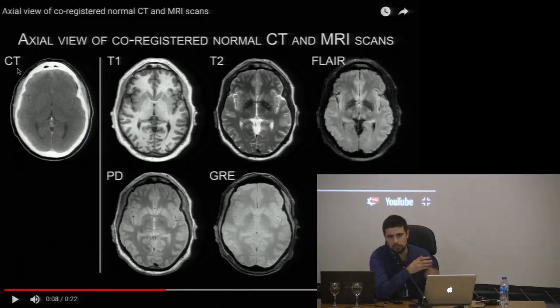Because you have to remember something: the MRI machine's magnet is always on. It's not something that they just turn off and on depending on whether something is inside. The magnet is always on and can only be switched off in case of an emergency, and then getting it back on is not something you do just by pressing a button. It's something that really thrashes the machine. So think about it. You have a room where no metallic object can be, and obviously this is dangerous to manage for the hospitals.